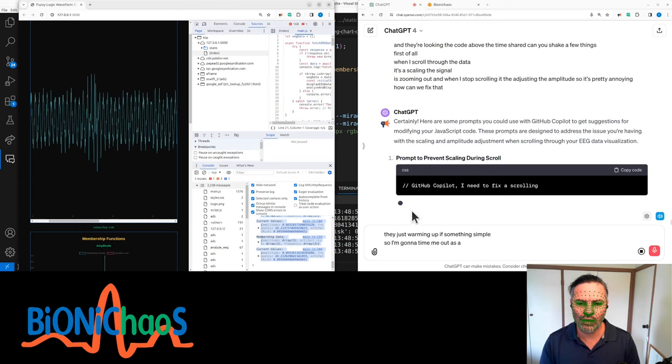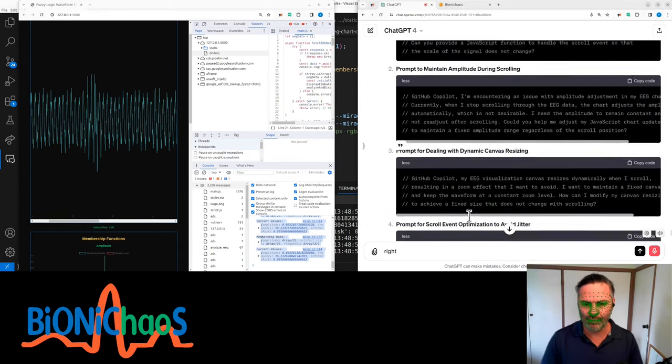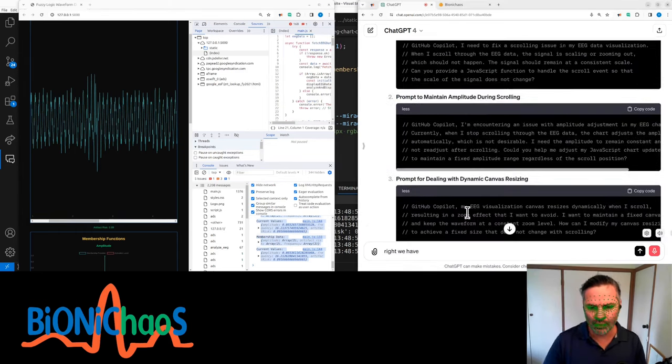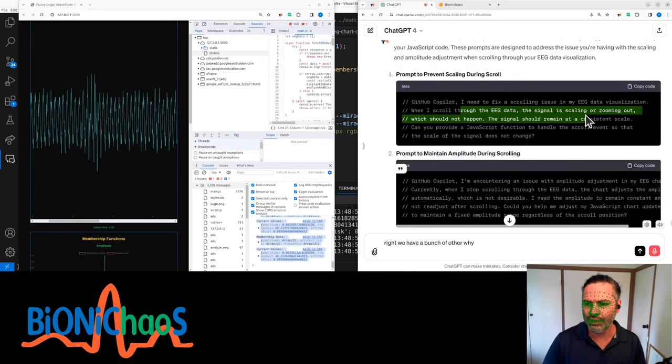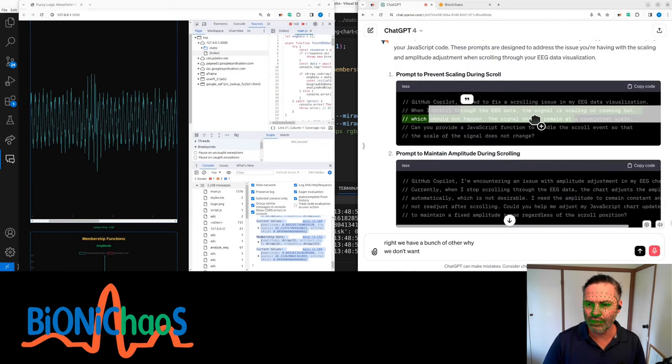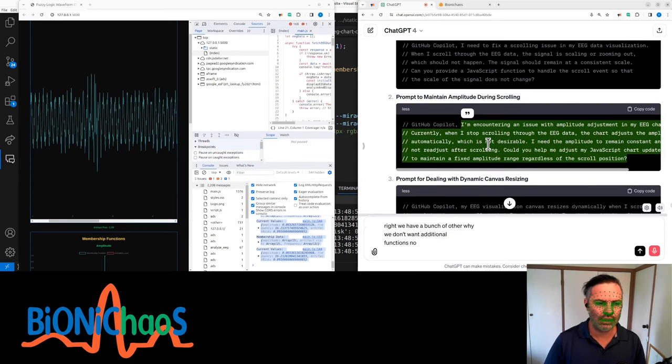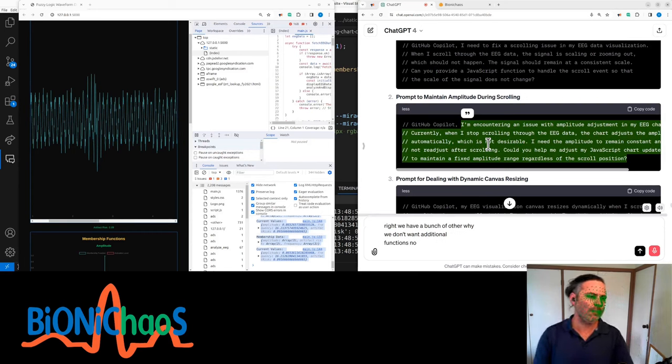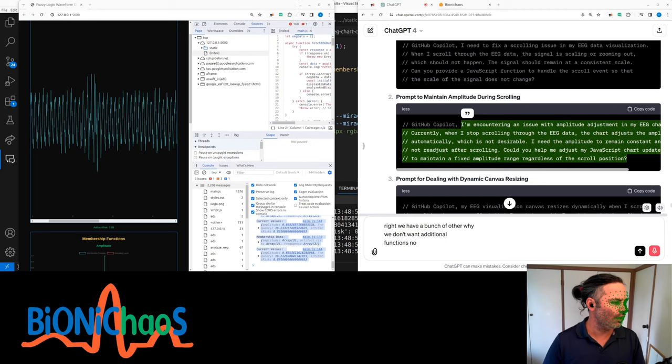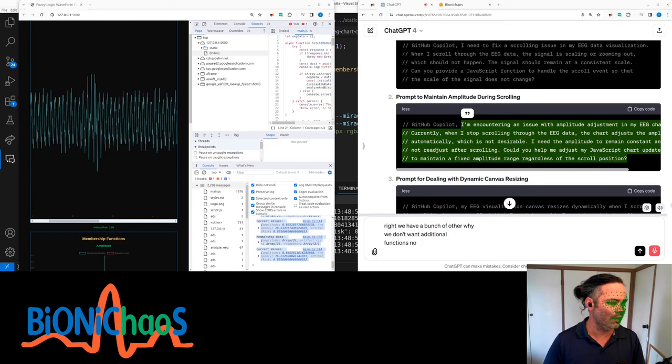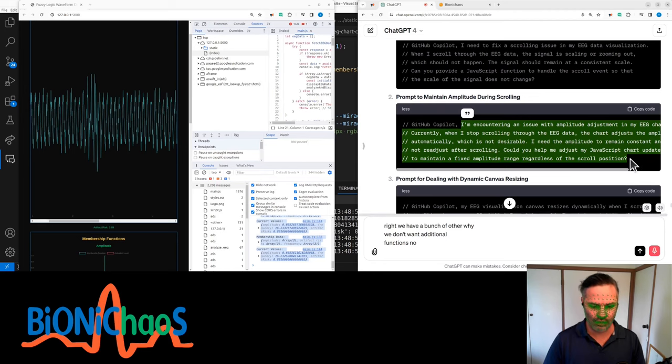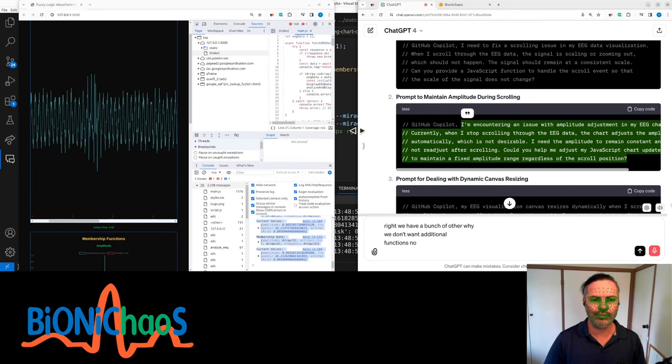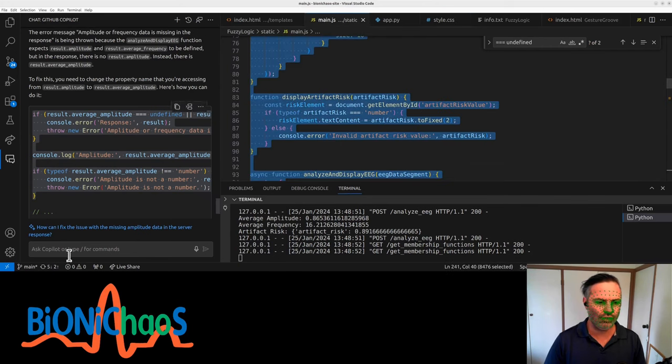Here are some prompts you could use with GitHub Copilot to get suggestions for modifying your JavaScript code. We don't want additional functions. I'm encountering an issue with amplitude adjustment in my EEG chart. Currently, when I stop scrolling through the EEG data, the chart adjusts the amplitude automatically, which is not desirable. I need the amplitude to remain constant and not readjust after scrolling. Could you help me adjust my JavaScript chart update function to maintain a fixed amplitude range regardless of the scroll position? Okay, that one sounds legit. Let's try it out.